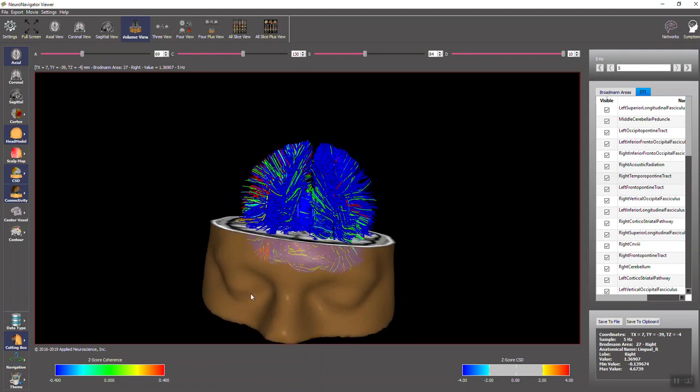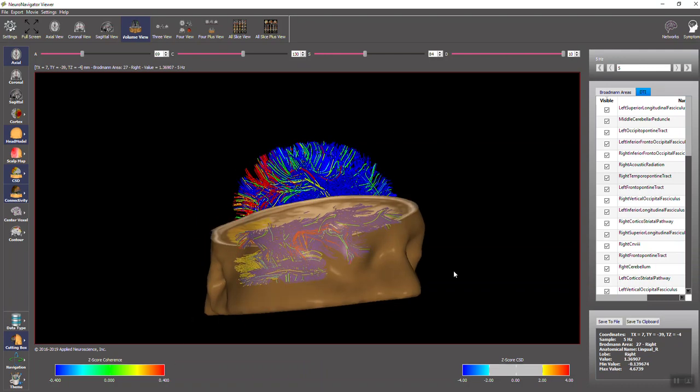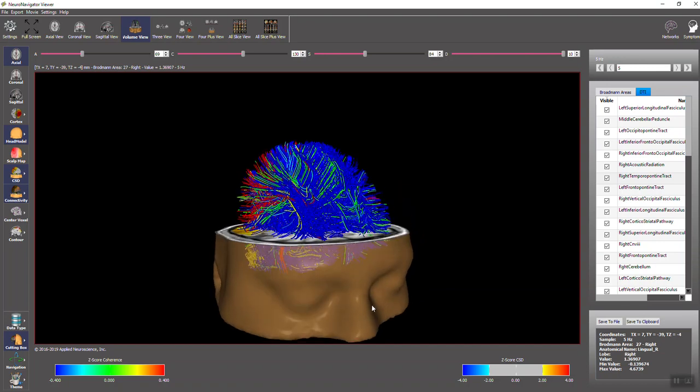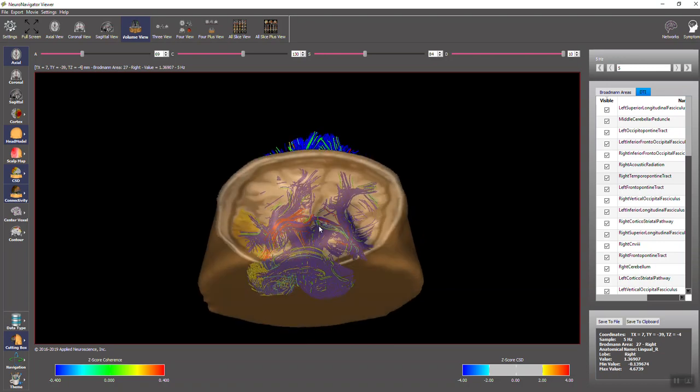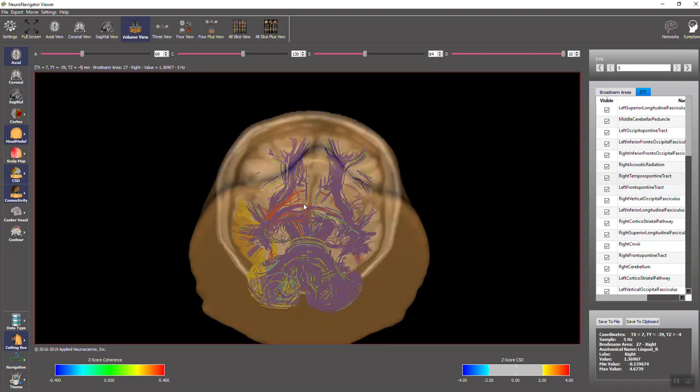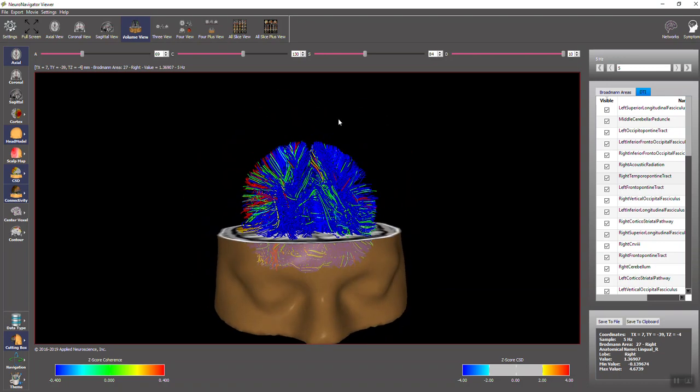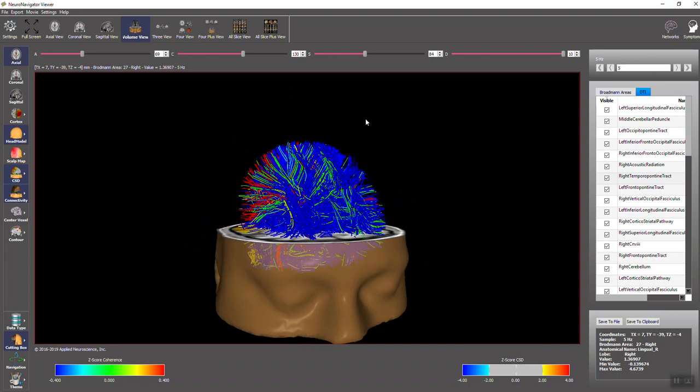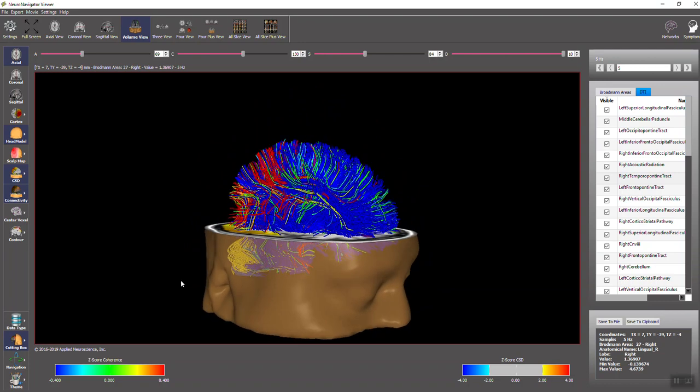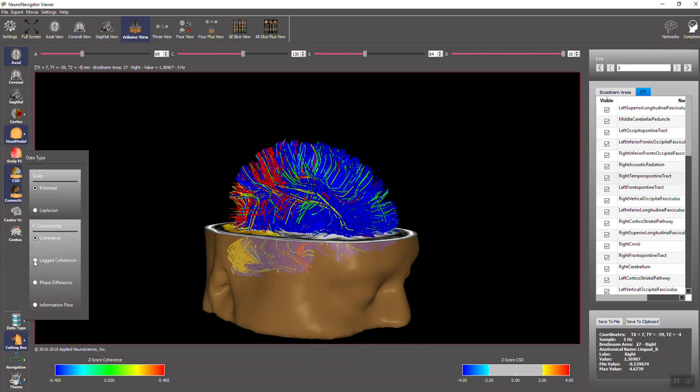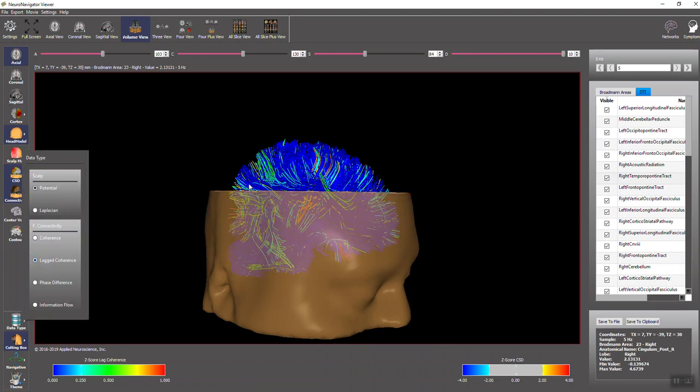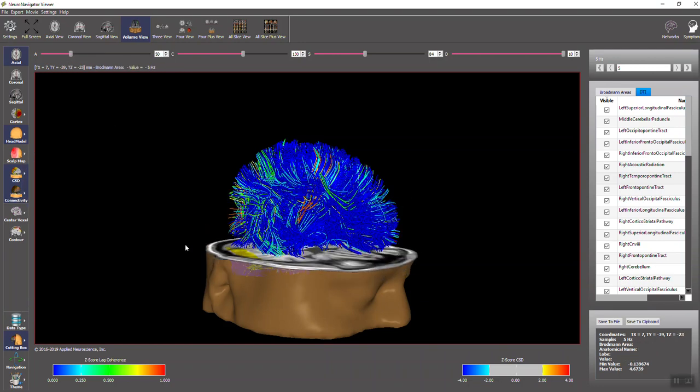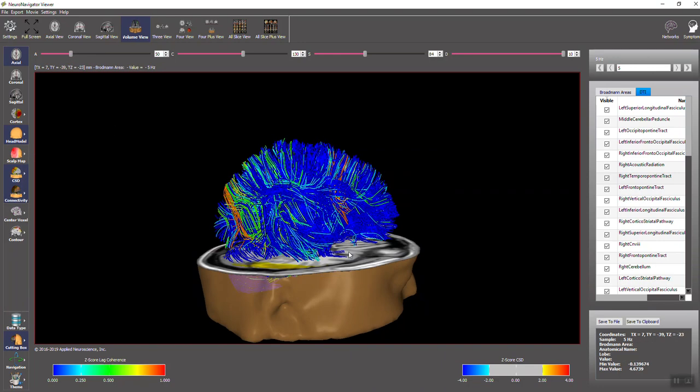We can look at other types of connectivity. For example, we can look at the lag coherence. This is instantaneous coherence, but we click data type, then click lag coherence, and now you're looking at the lag coherence deviations from normal.